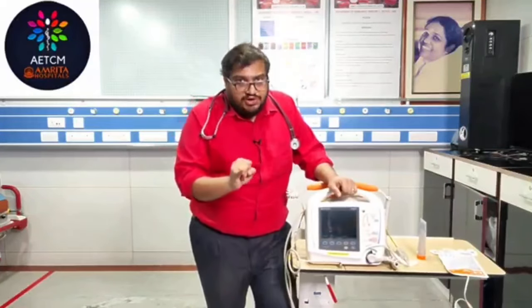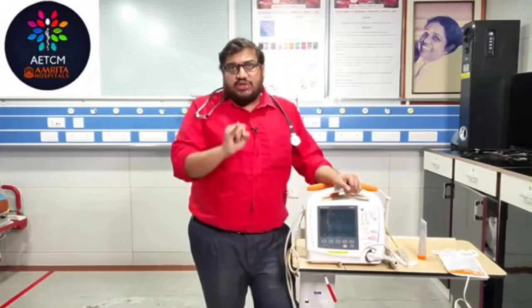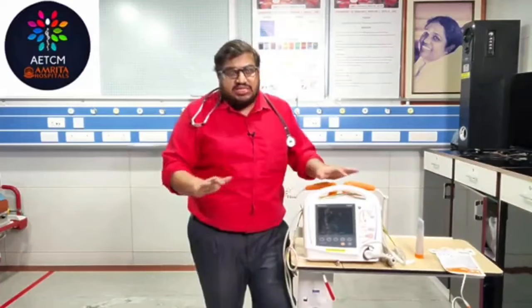So that is regarding defibrillation. Remember, we use defibrillation only in case of a shockable rhythm in a cardiac arrest, that is pulseless VT and ventricular fibrillation. There is no synchronization, there is nothing else. We are just selecting the energy, the maximum amount of energy. If you are able to remember, it is 200 joules of energy for a biphasic defibrillator. In case of a monophasic defibrillator, 300 to 360 joules of energy.